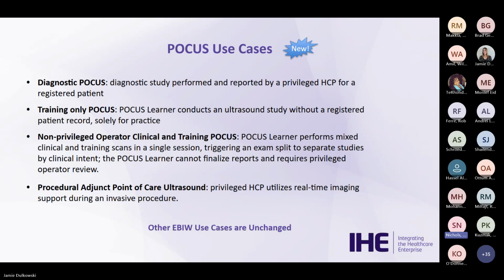in the POCUS space. So the diagnostic POCUS, that's your typical diagnostic study performed by a privileged healthcare provider on a registered patient. So this is your happy path use case. A training only is a POCUS learner conducting an ultrasound study without a registered patient. So they're performing POCUS on a coworker or in a lab. This is solely for practice.